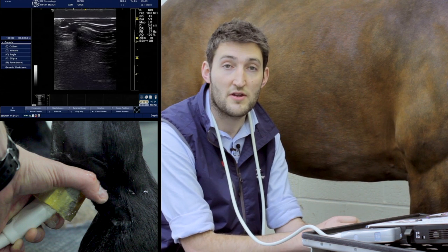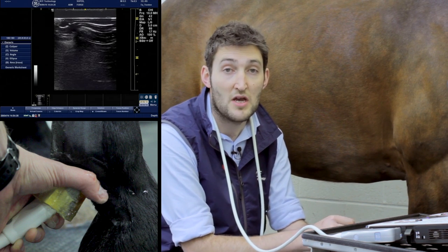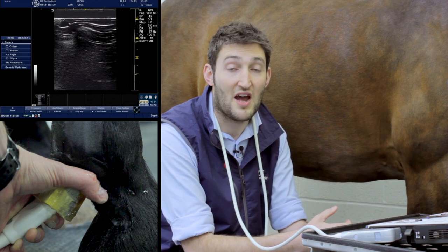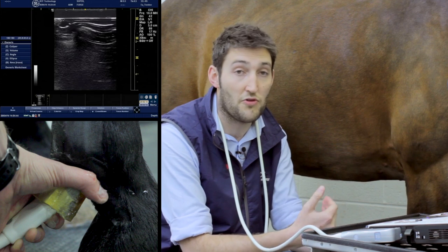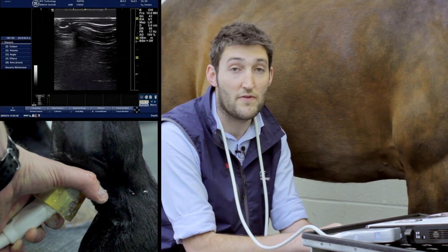We're just going to do a short section now on ultrasonography of the palmar or plantar pastern. The anatomy between the forelimb and the hind limb at the pastern is pretty much similar ultrasonographically, so we'll just concentrate on the forelimb, and the same sort of applies really for the hind limb.